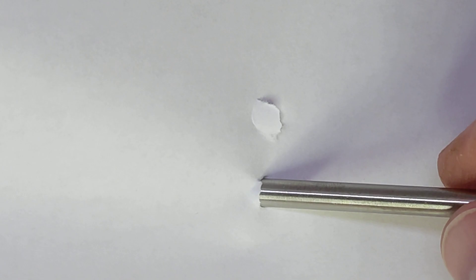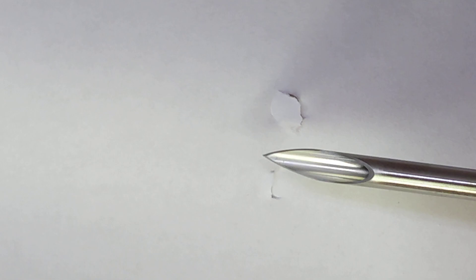We oftentimes suggest bevel down, and when you do bevel down you can see that the skin on the top is just following the needle and the skin on the bottom due to the angle is going to just fold down. So there's nothing getting caught inside the needle.